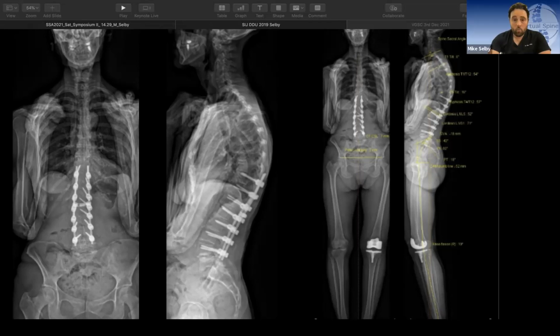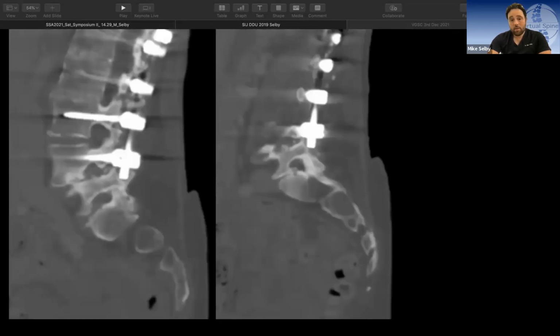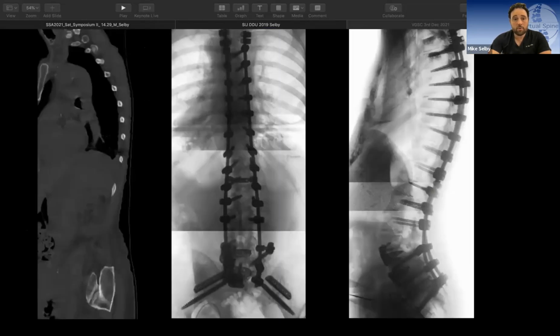Yeah. And look, I think what doesn't appear as well on this imaging is that probably the screws are just on the end plate there at the cranial level, but also she probably has about 3 to 4 levels of quite severe disc degeneration through that mid-thoracic region, which wasn't really there on her imaging prior to her initial surgery. So she's just wearing everything out. And the other issue I've got here is the location of these screws, really eroding into the pars there. So I think it's a bit of an unstable situation, and you've got to get all those screws up a bit higher and be able to recontour the rod going into the pelvis.